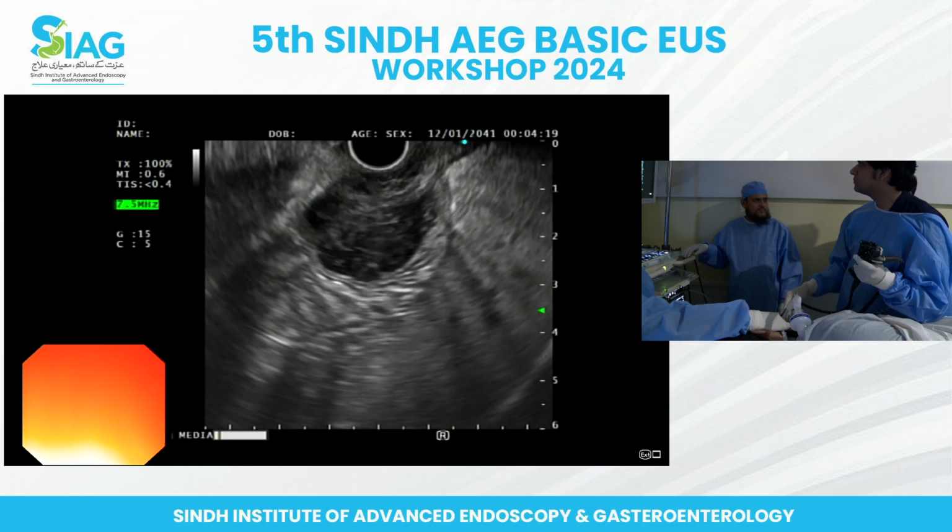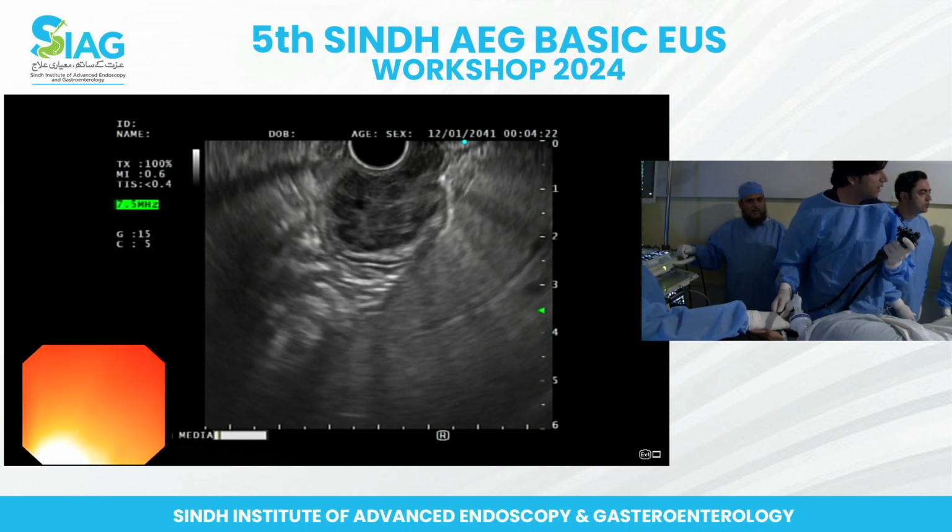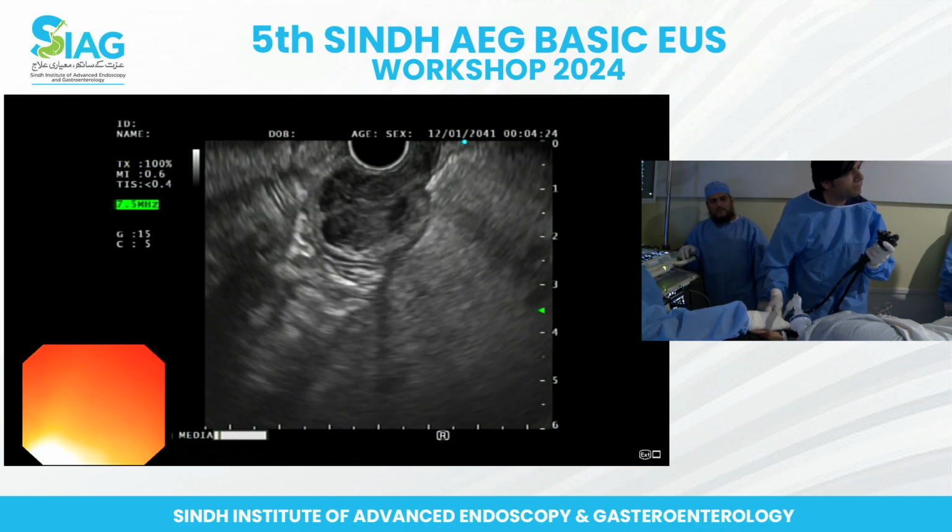Do you want to quickly go into D1? Okay. Sure. Let's show Khalid. Yeah. Okay.